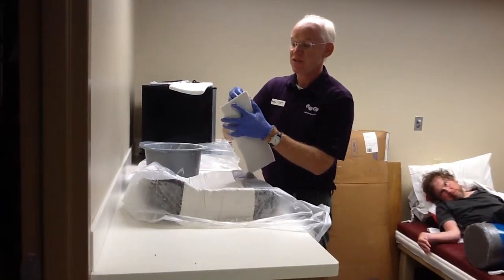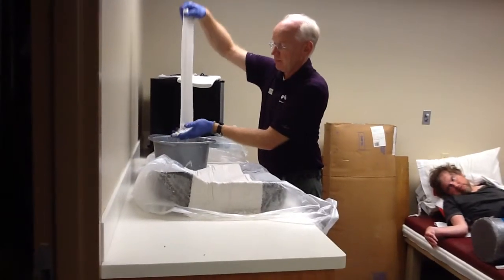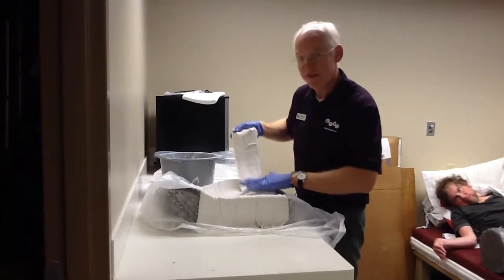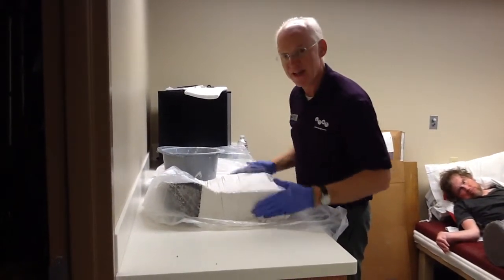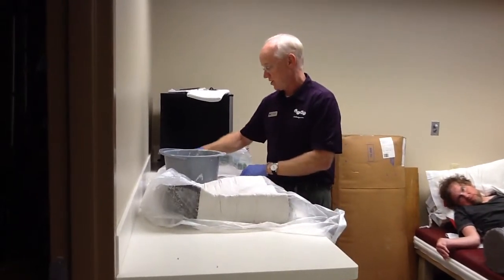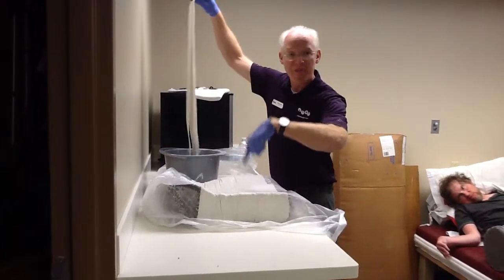So we'll make this cast. Once this cast dries, we'll be able to pull this cushion out of the cast, put the cover back on, and send that home with the client. We'll then be looking at this cast of this cushion. We would fill out a simulator-based Ride Custom Cushion order form — and instead of looking at the blue impression foam, we'll be looking at this cast.